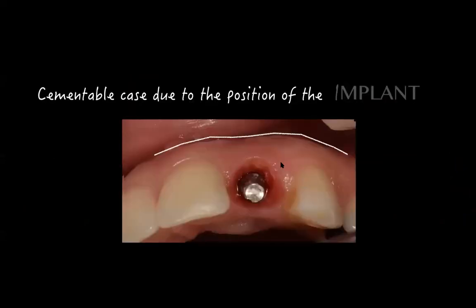And going back, is this a success, or you call it not a failure, but something less than what we anticipate to get in the aesthetic zone. So here's another case on a cementable, just to let you know, an immediate load case. I placed an implant. Again, it didn't work out.